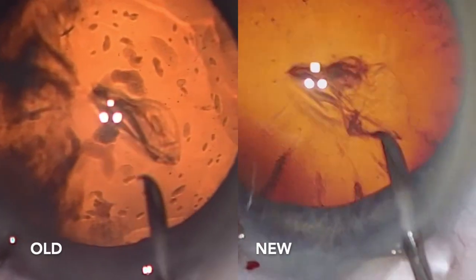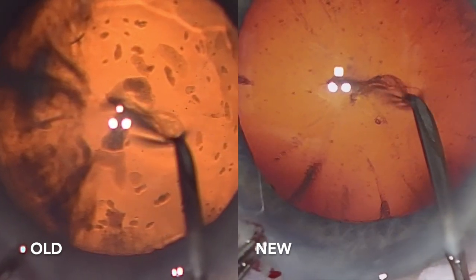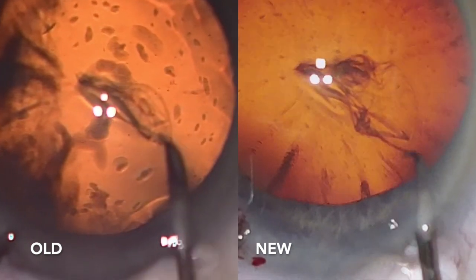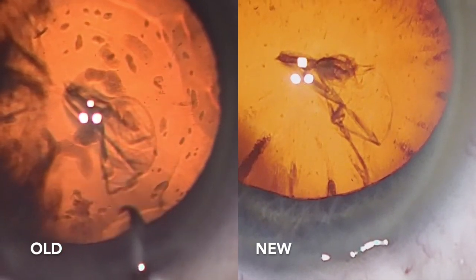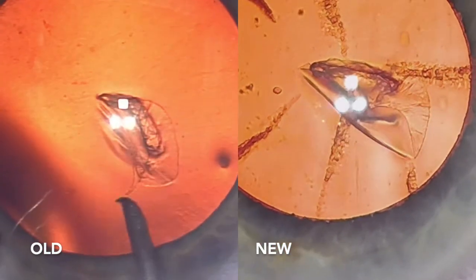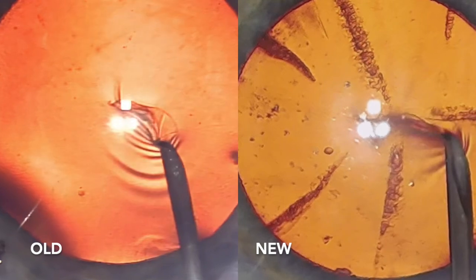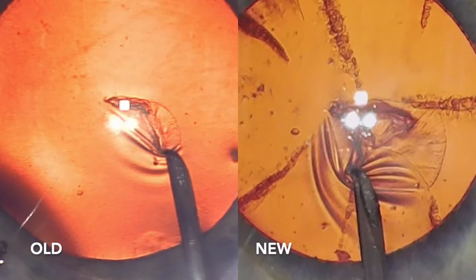Let's show both these techniques side by side. I'm going to show this in slow motion — slowed down to one quarter speed. The new technique is on the right-hand side here. I've done this for the last 500 cases or so. We'll slow this down to one quarter speed so you can appreciate the difference in technique. Feel free to pause the video and rewind to appreciate the mechanism behind this technique.